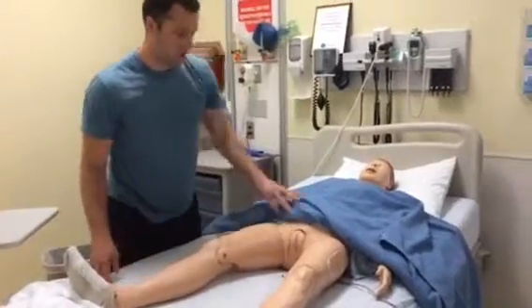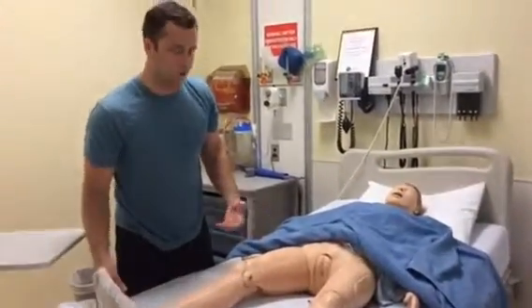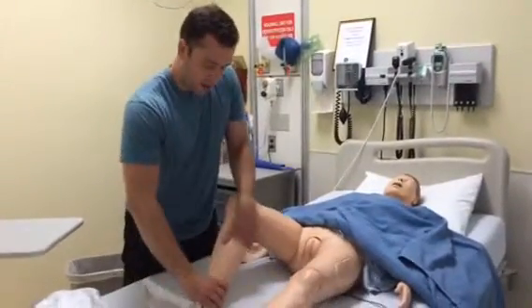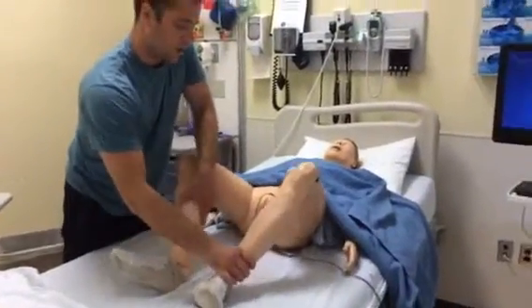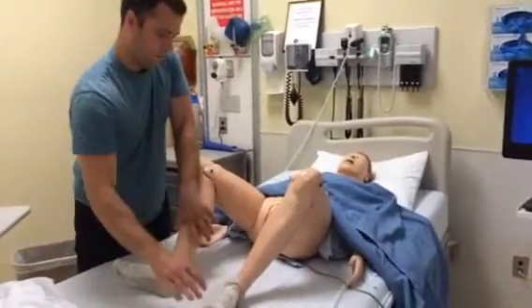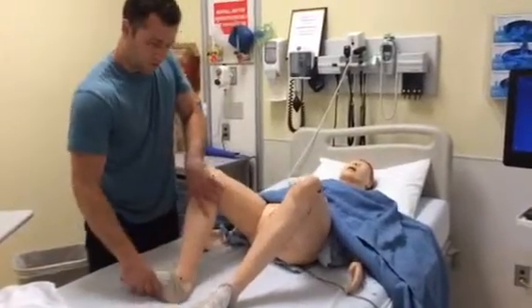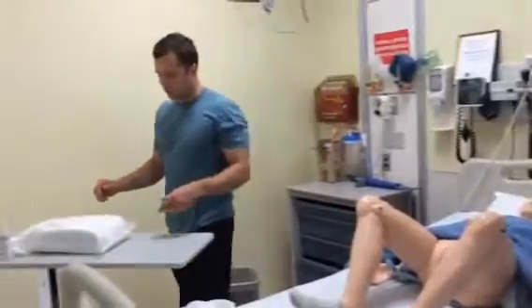And at this point I would check the periurethral area to see if it's visibly soiled and if it needed to be cleaned. We're going to assume it's not. And so what I'll have you do is pull your knees up to the side, and it looks like this is as far as this mannequin is going to want to go. And so we'll just roll with it. Okay. So I'm going to open my catheter kit now.